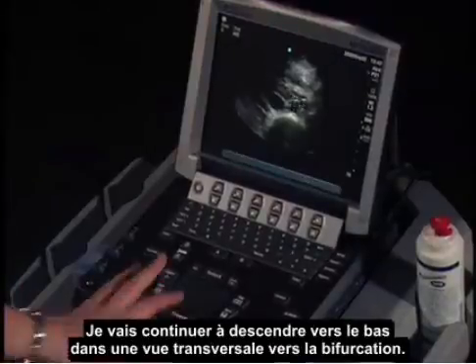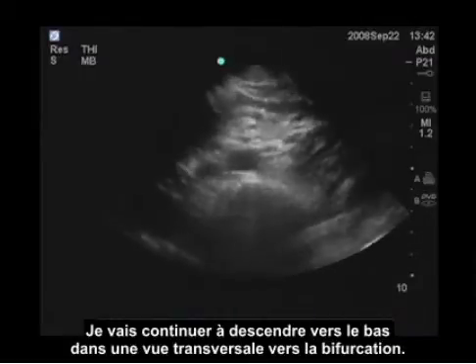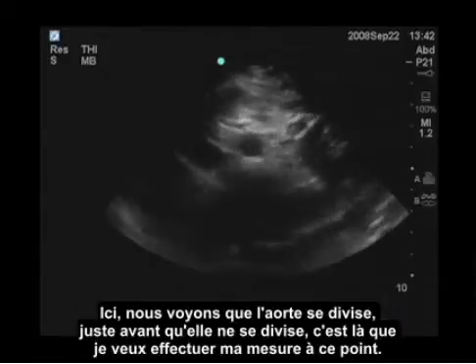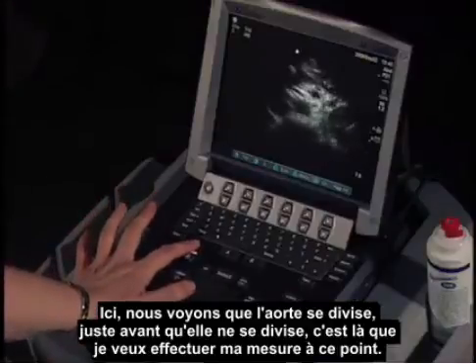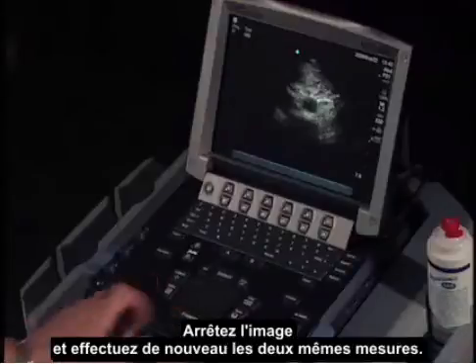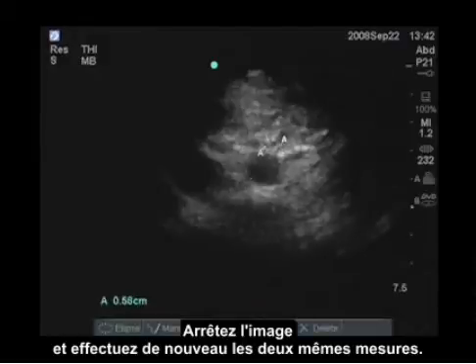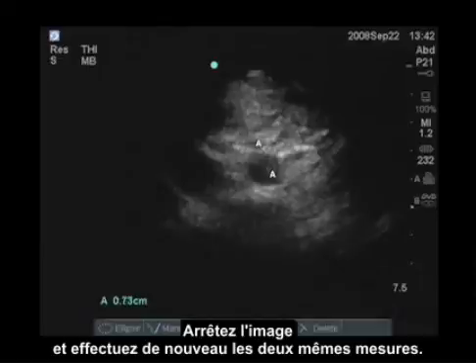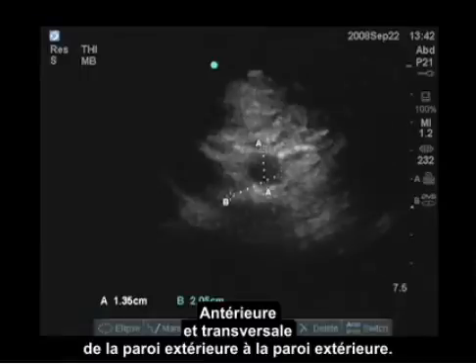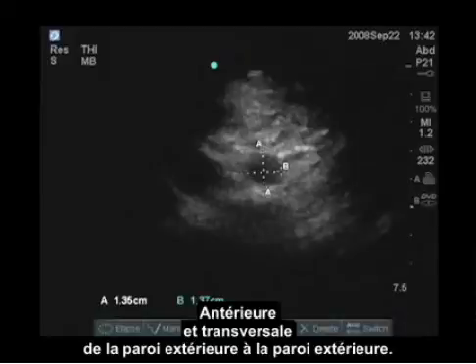I'll keep moving down in a transverse view towards the bifurcation, and here we see the aorta divide. So right before it divides, I want to perform my measurement at that point. I will freeze and perform the same two measurements again — anterior and transverse, from outside wall to outside wall.